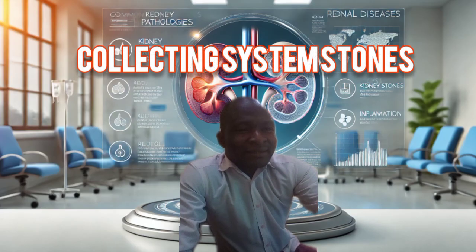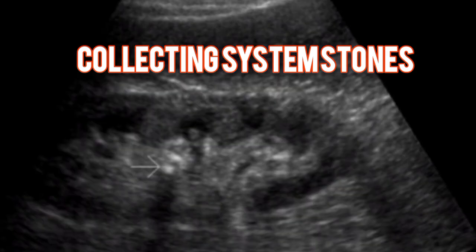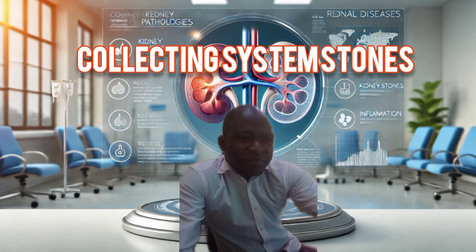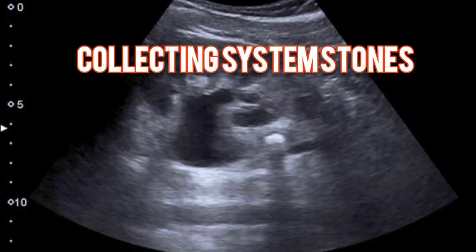Let's look at collecting system stones. The reflectivity of stones in the renal sinus may be equal to that of the renal sinus itself. Therefore, sometimes it's difficult to distinguish the stone in the renal sinus. If the patient is scanned in a hydrated condition, the fluid in the sinus outlines the calculus and enables better visualization of the calculus versus the echogenic renal sinus.